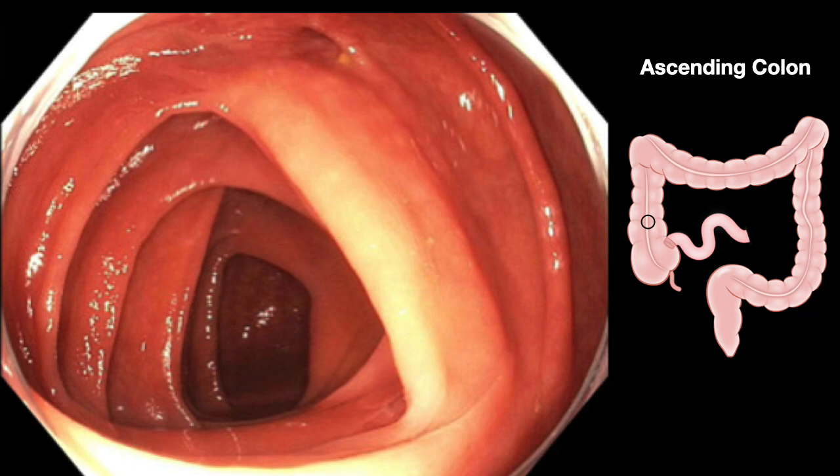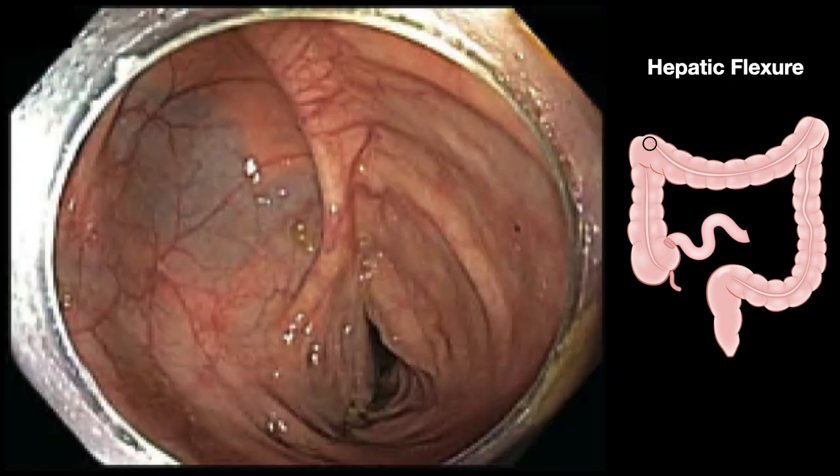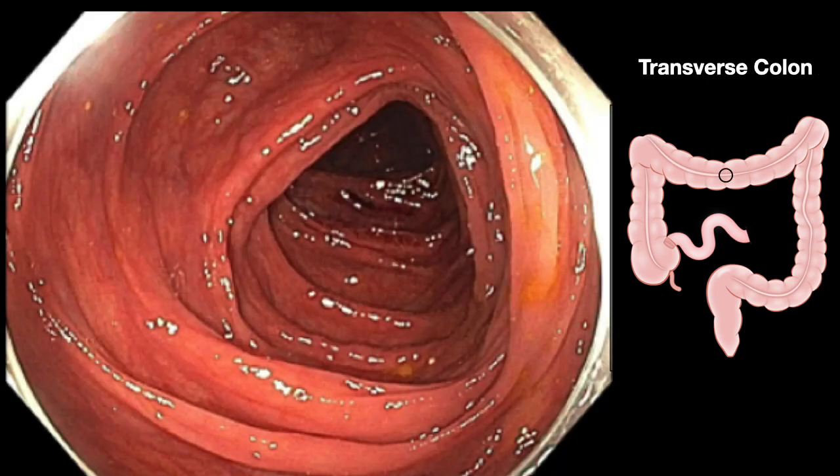And then as we come back under the liver, the hepatic flexure, the liver can be seen through the wall of the colon. It gives a bluish hue. So this is the hepatic flexure, and you can see the bluish hue of the liver. And as we come back into the transverse colon, you have these triangular folds, which are classic for the transverse colon.